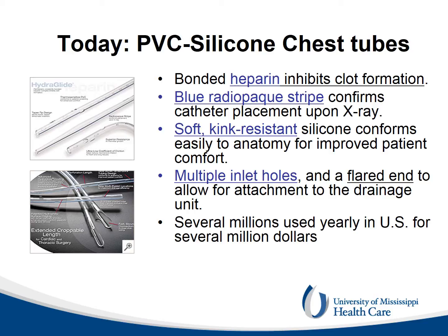They have a radiopaque stripe to show the intrathoracic position and the location of the sentinel hole. The sentinel hole is the hole in the chest tube wall closer to the skin entrance. It needs to always stay inside the chest to avoid the entrance of air and collapse of the lung, so-called pneumothorax. The larger sizes are relatively kink resistant.